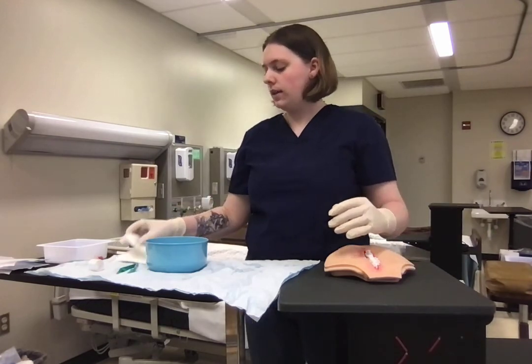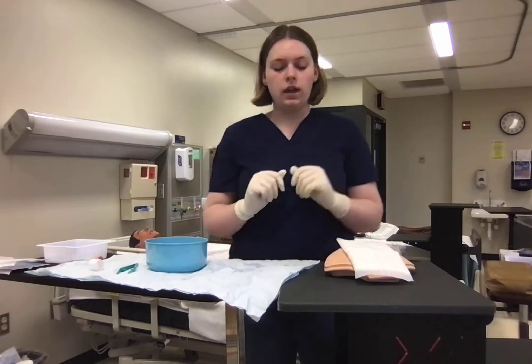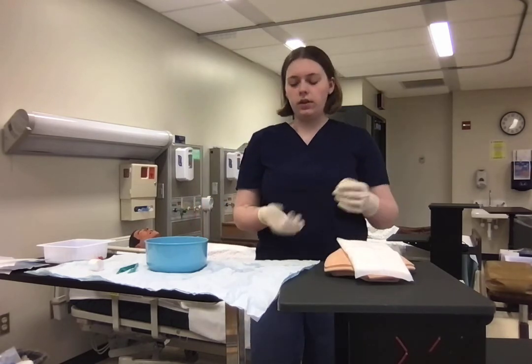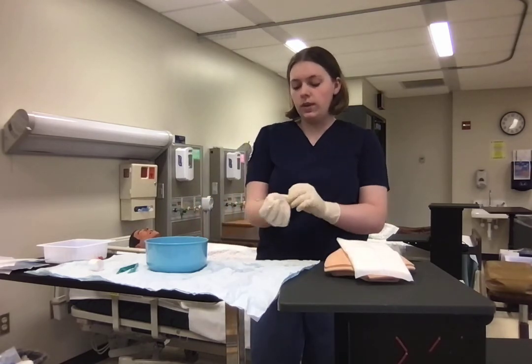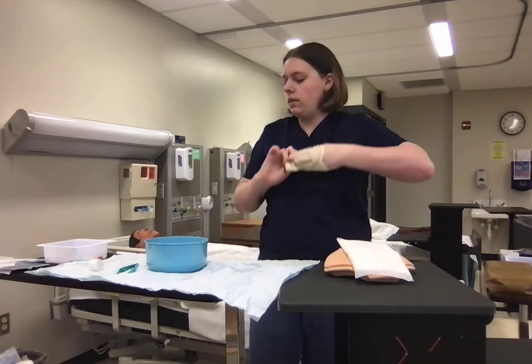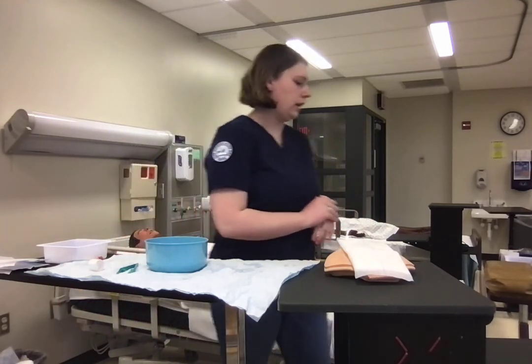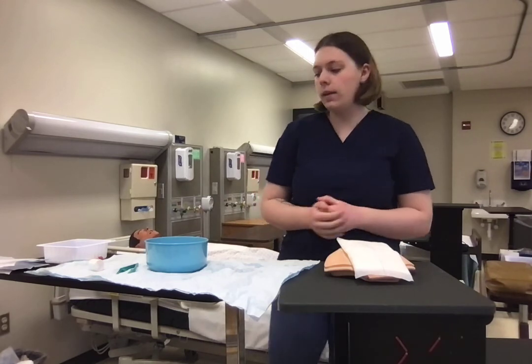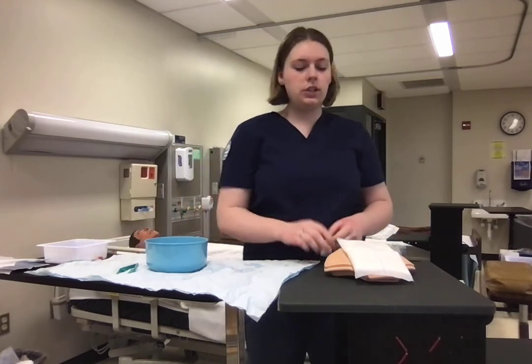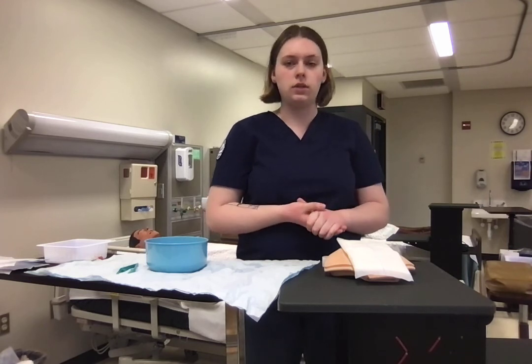I'm going to take my ABD pad and I will place it over the wound. And at this point, I no longer need sterile gloves. The wound is covered. So I'll remove my sterile gloves. Throw those in the trash. Perform hand hygiene once again. And at this point, I am going to tape up my bandage and I will mark it with my name, the date, and the time that the dressing was changed.